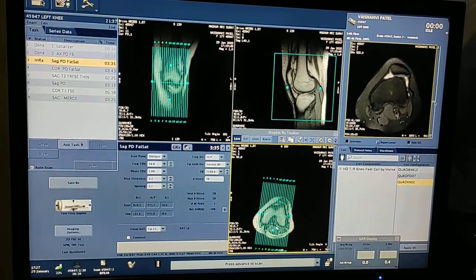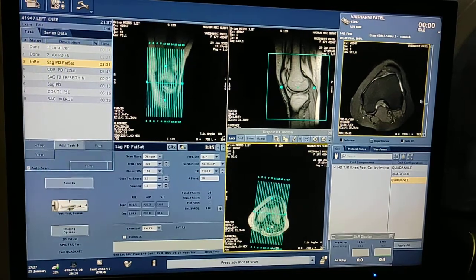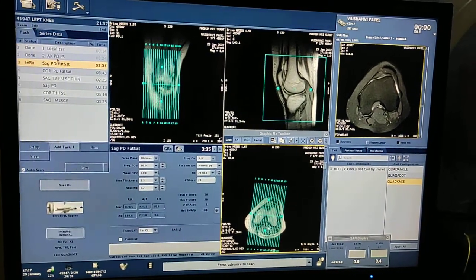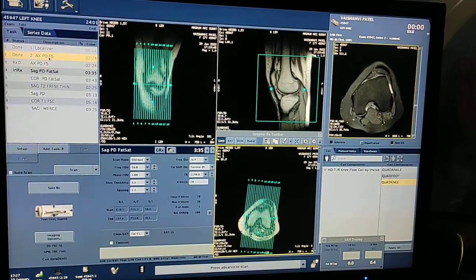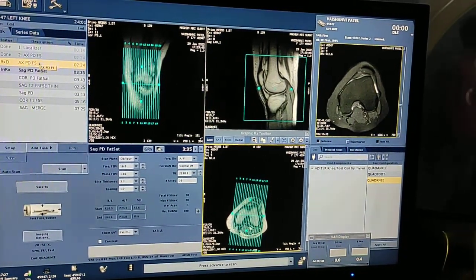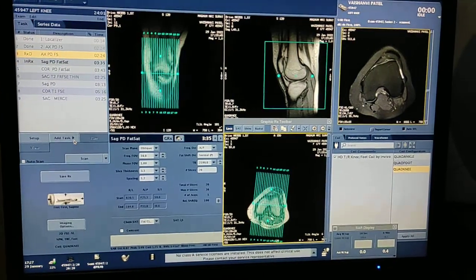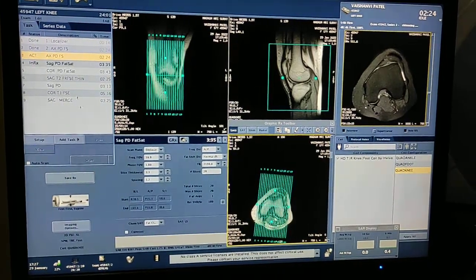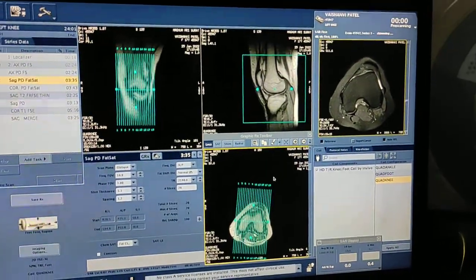The axial FS PD is now generated, but the patient is slightly uncooperative — the images are showing motion artifacts. So I am going to rescan. Simply copy this axial FS PD sequence, click copy and paste, and it will come next to the previous sequence. There are slight motion artifacts, so I have to re-scan the axial FS PD. Now I have a good axial FS PD and I am planning the rest of the sequences.